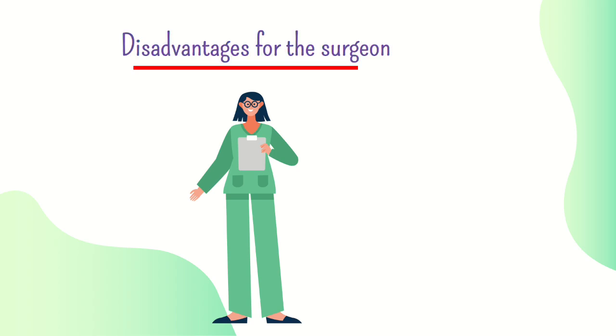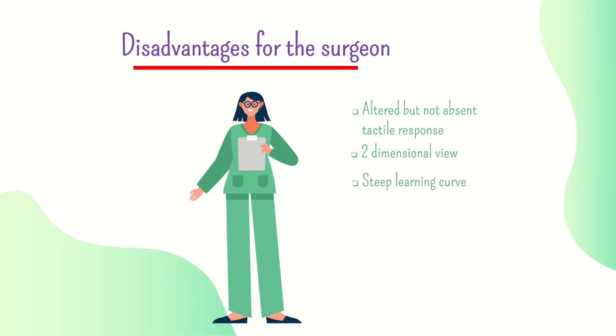Meanwhile, the disadvantages for the surgeons are: laparoscopy gives them an altered but not absent tactile response, which means the sensation on the fingertips are altered because of the lap equipment they use. The surgery only offers a two-dimensional view of the operative site, and this is where a good cameraman would come in handy. There's a steep learning curve for surgeons.